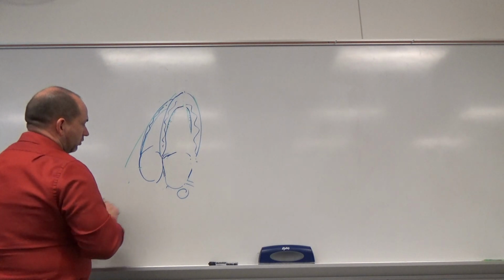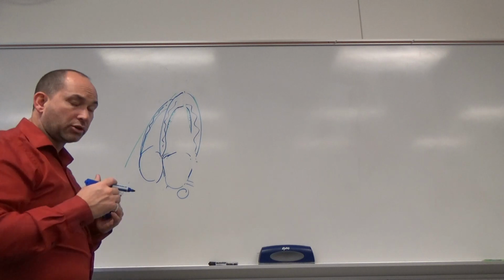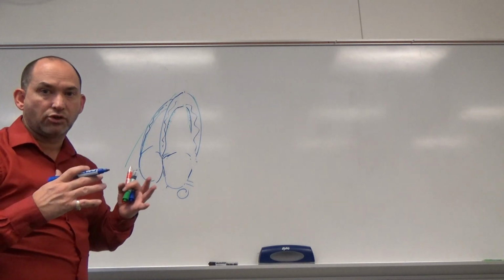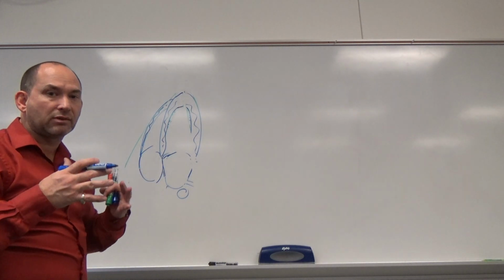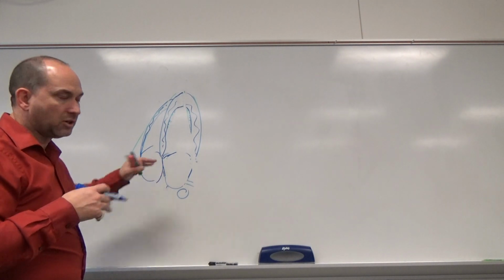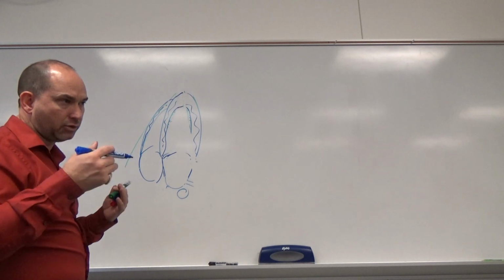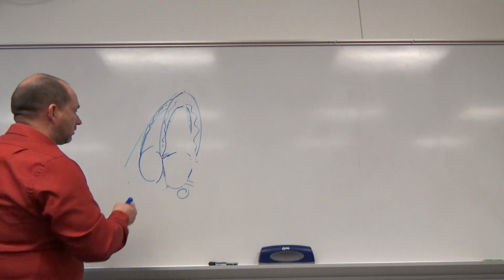So in the right ventricle, we are looking at the tricuspid valve. We're looking for calcifications, thickness, masses, things that are attached to it, broken valves, etc. Looking to see that it coapts and closes properly and does not leak, although tricuspid valve virtually always leaks.